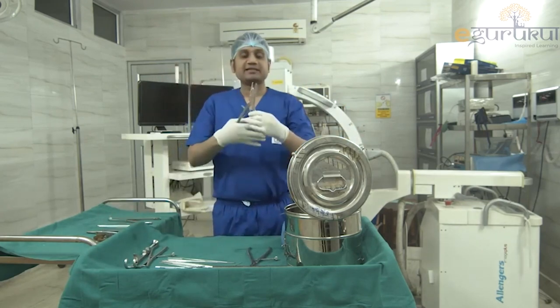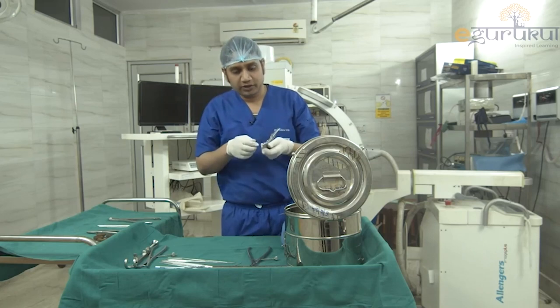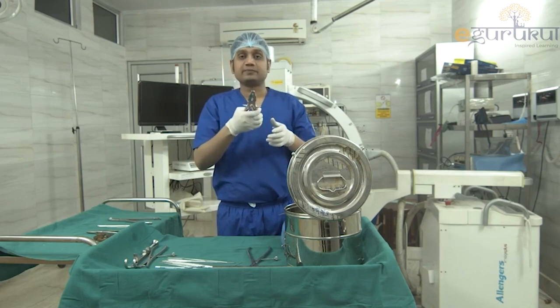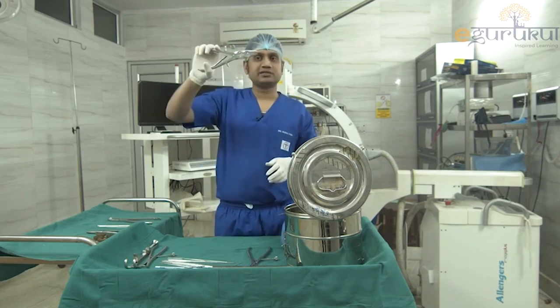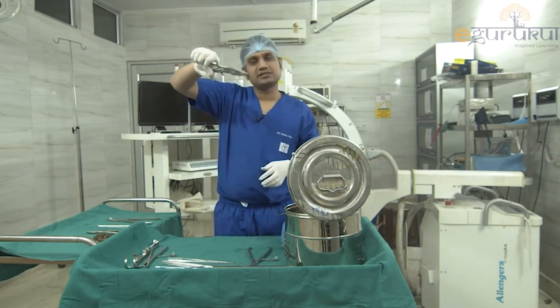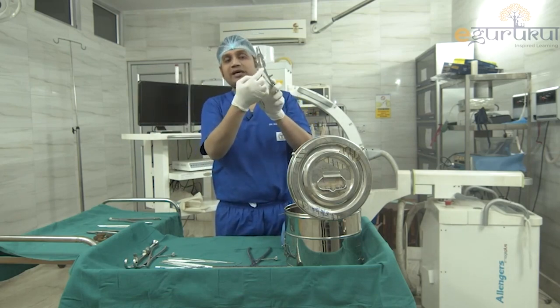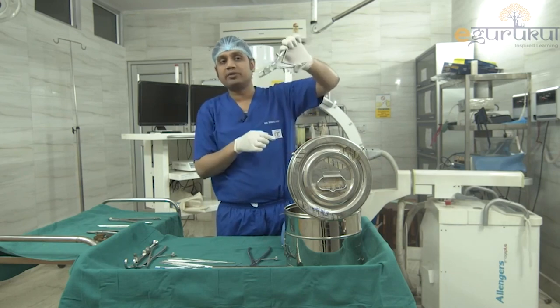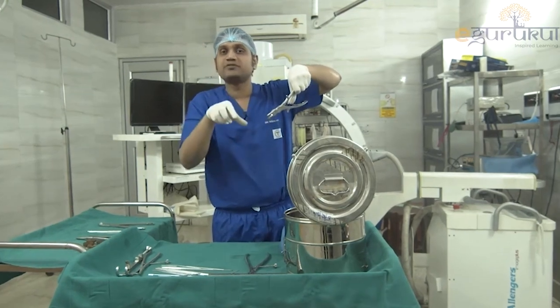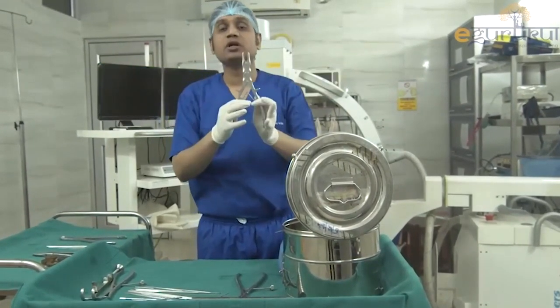Next is the bone nibbler — it has a crocodile mouth appearance. This is a dual-action bone nibbler: one action here and one here. The slots in the jaws allow you to grab fragments of bone and nibble them out.